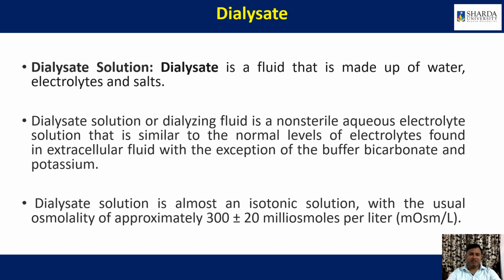Now come to the dialysate. So we will study the dialysate that is filled into the dialyzer. What is the composition of the dialysate? Dialysate is a fluid that is made up of water, electrolytes and salt. Dialysate solution or dialyzing solution is a non-sterile aqueous electrolyte solution that is similar to the normal level of the electrolytes found in the extracellular fluid, except bicarbonate buffer and potassium. Dialysate solution is an almost isotonic solution with the usual osmolarity of 300 plus or minus 20 milliosmol per liter.